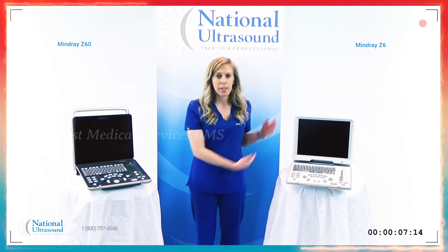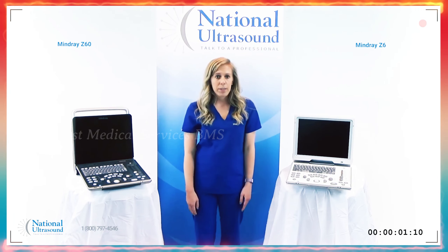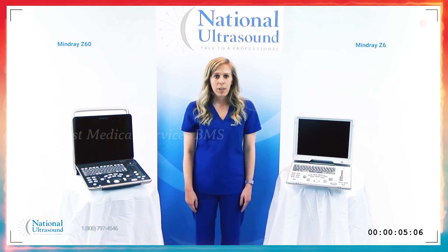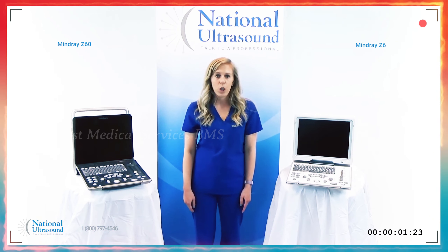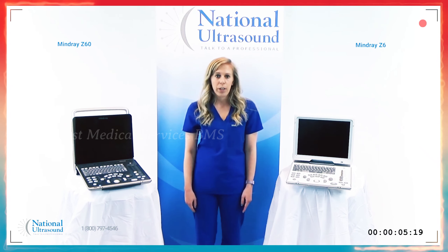I'm at National Ultrasound comparing the Z6 with the brand new Mindray Z60. The Mindray Z60 is a new upgraded model of the Mindray Z6. The Mindray Z60 ultrasound system is the perfect solution for the practice looking to perform consistent OBGYN, basic cardiac, vascular, and general imaging exams.